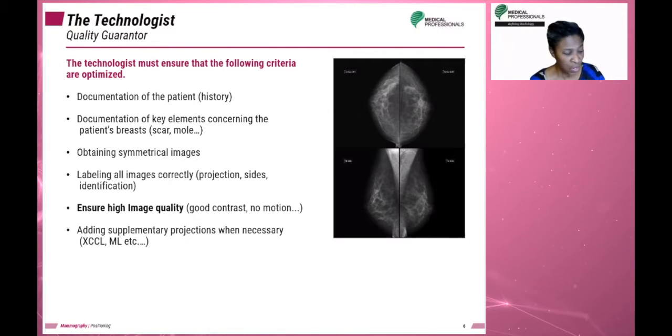Type of aspirations, this is the type of surgery that the patient may have where they simply had an aspiration done. Again, you want to make sure that you are exact. Mastectomy, one or both breasts, again, make sure this is properly documented. If the patient has had any type of radiation treatment, typically if the patient has had recent radiation treatment, you may not necessarily want to have an immediate mammogram. So this is something you would have to check with the radiologist, find out how soon after the radiation treatment do they want to have the mammogram.